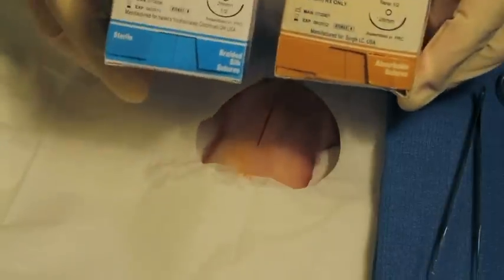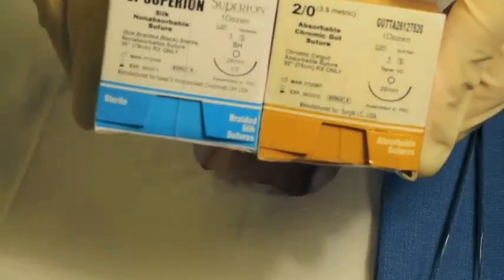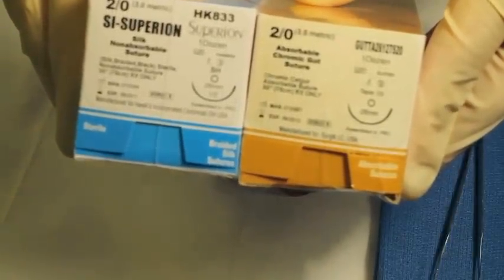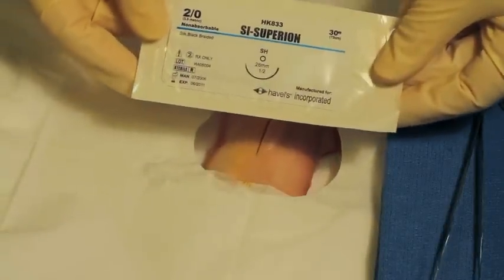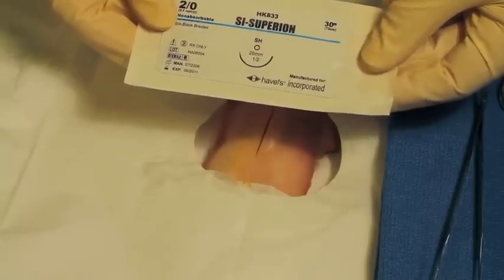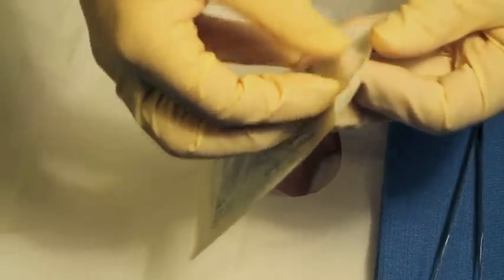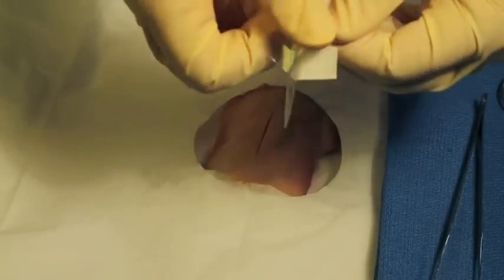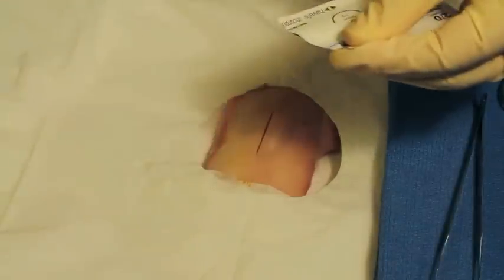Here are our sutures. The suture on the right is an absorbable suture, used for inside suturing, and the blue one is a silk suture, which is a common one used for the skin — we're going to use that today, and that's 2-0 silk. Zero silk is the thickest suture and 6-0 is very very fine work. Go ahead and open the package just like you would open anything else. There's your silk suture — Superion is a brand name and it's an excellent suture.